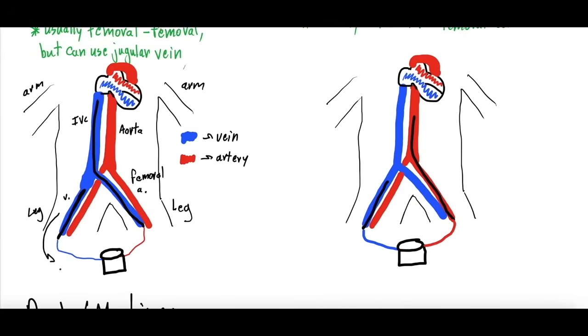It's deoxygenated blood that has traveled through the body already and was on its way back to the heart to get pumped into the lungs and get oxygenated. It goes through the ECMO circuit, gets oxygenated, so now it's red, and it gets pumped back into the femoral vein, going from one vein to another vein.